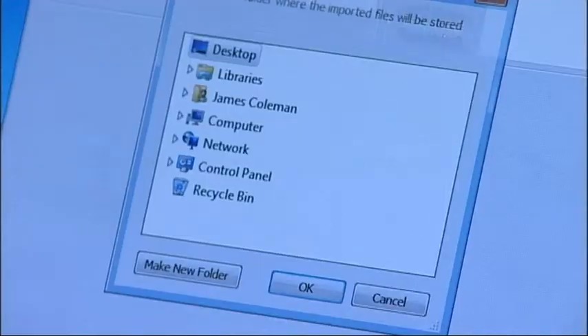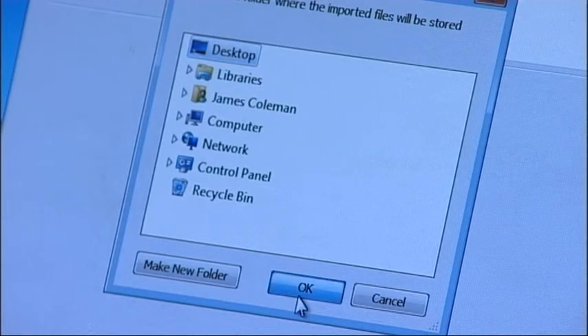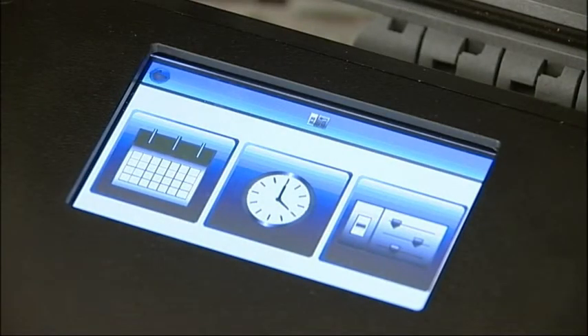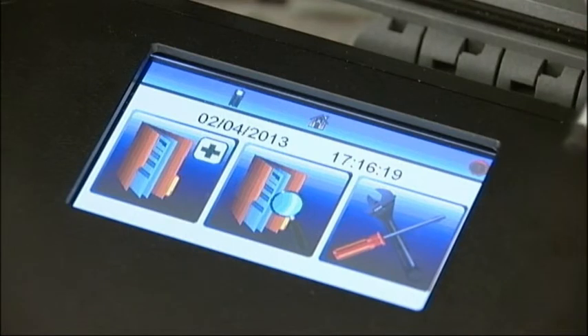You'll then be able to choose the location where you'd like the test results to be stored. When the instrument has completed exporting the results, you can choose whether to delete the results from the SafeAir Tester's memory. Once you've finished using the F6000, to turn off the instrument, use the return arrows to go back to the main menu and press the Power Off button in the top right-hand corner of the screen.